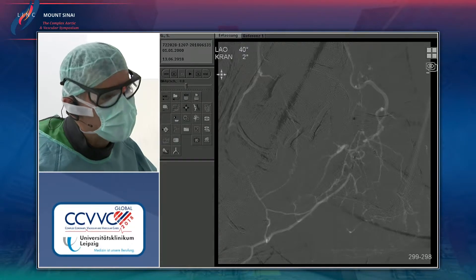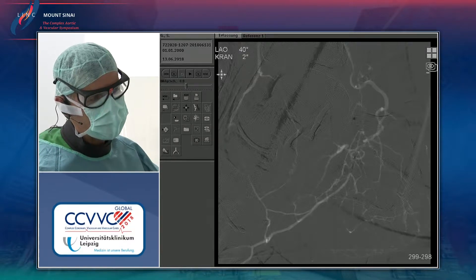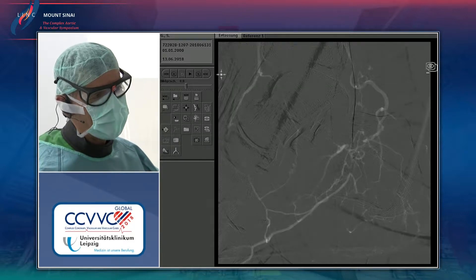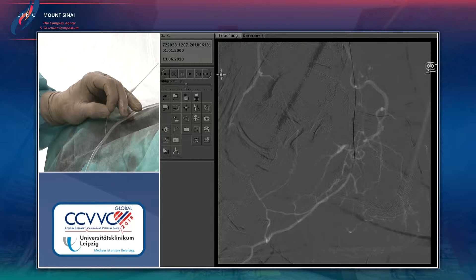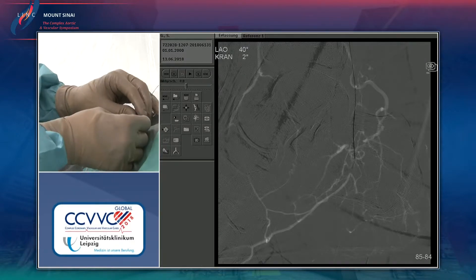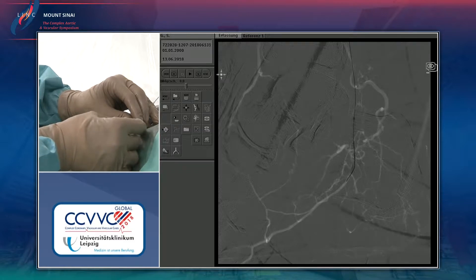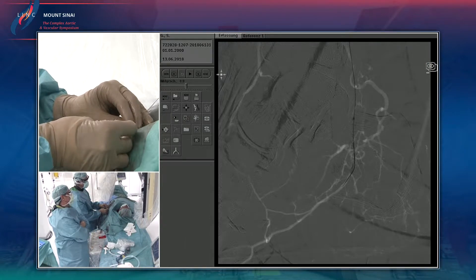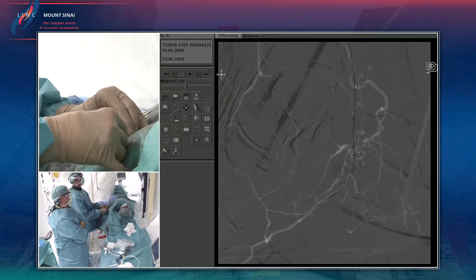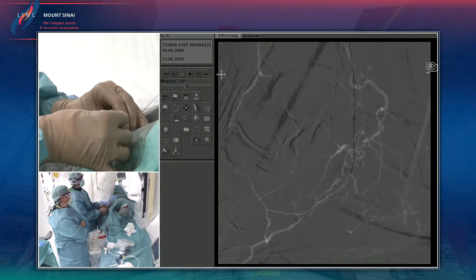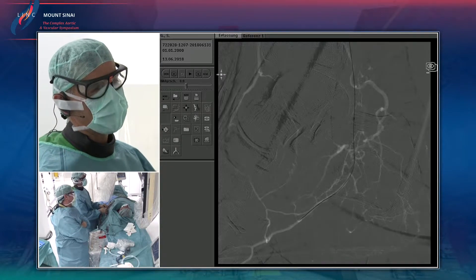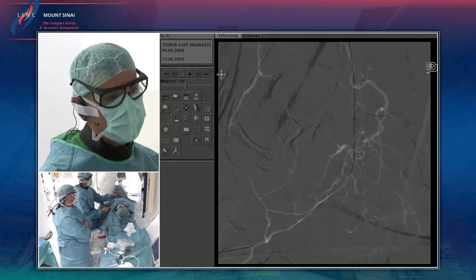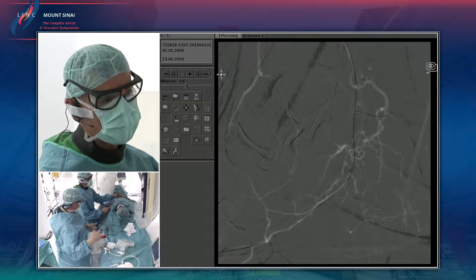A two-centimeter-long coronary balloon — a 2.2 Mini-Track — has been loaded, with the wire tip at the distal end of the balloon. The wire is now in position. The question now is whether to go through the foot loop and treat the anterior tibial artery, or whether it is sufficient to just balloon the plantar branch here.